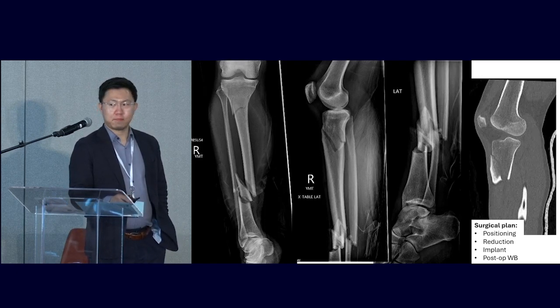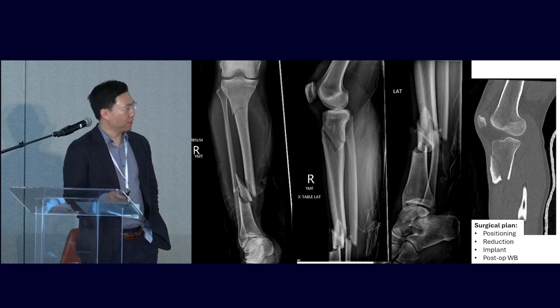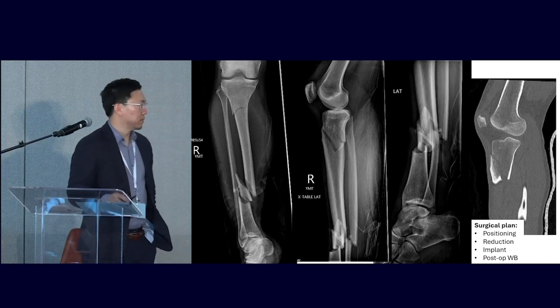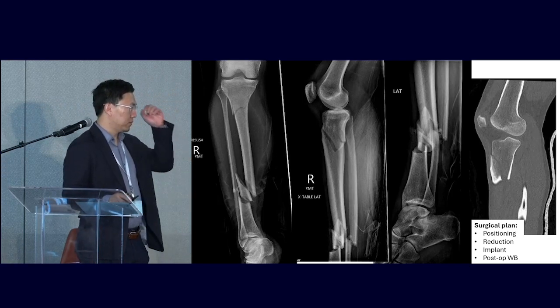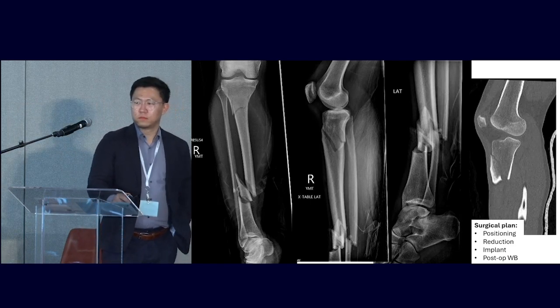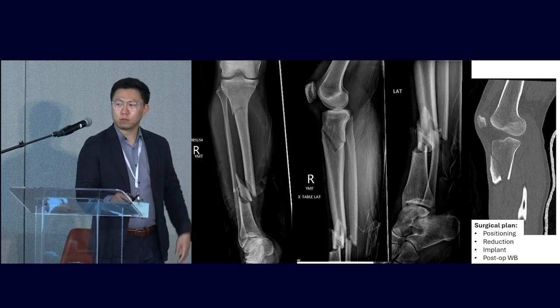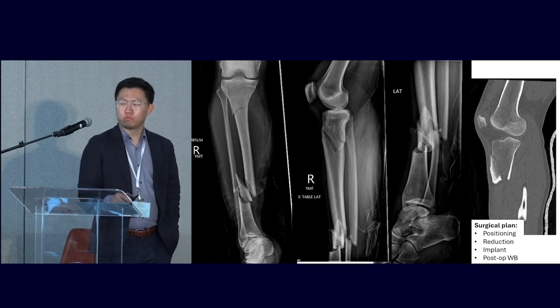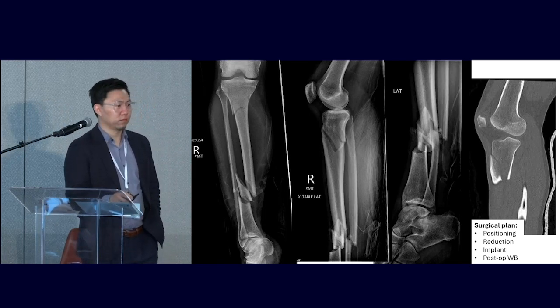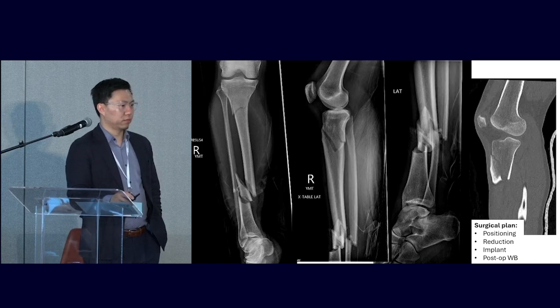Is the distal fracture open? Yeah, it's open, a small pocket. I would do a short segment plate for the top. You could use a plateau plate and nail around it, or a little mini plate there. And distally, I'd open it and wash it out and probably put a plate there too. And I would take that plate off after it's nailed. I'd leave the proximal plate on. Andy, you got help there, and you're not by yourself, so you could do pretty much anything you want.